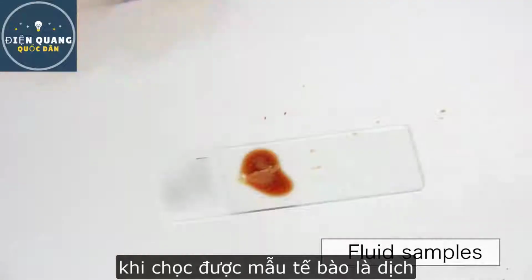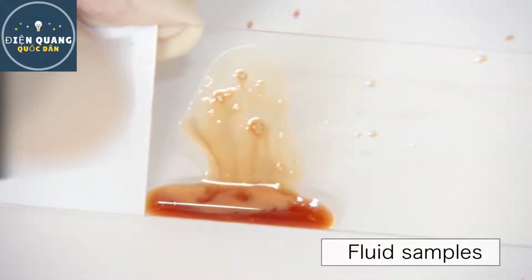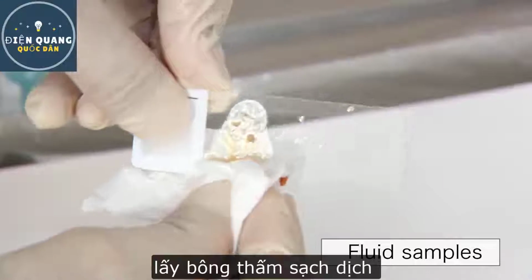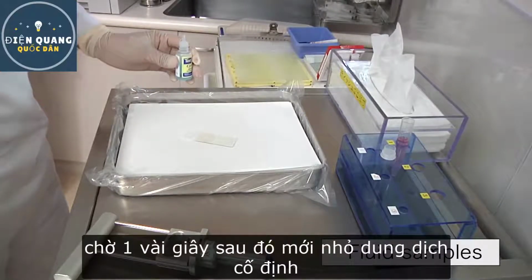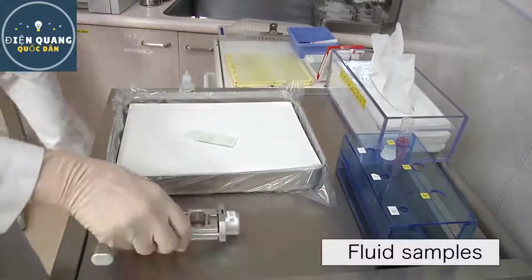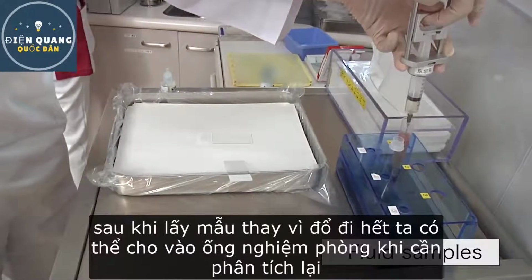When we aspirate fluid samples, we slowly tilt the glass slide and remove the excess material and wipe up the fluid flowing from the glass slide. Then perform the press and release method. On fixation, we wait for some seconds until the cellular components adhere to the glass slide. For fluid materials, liquid-based cytology is also recommended instead of conventional preparations.